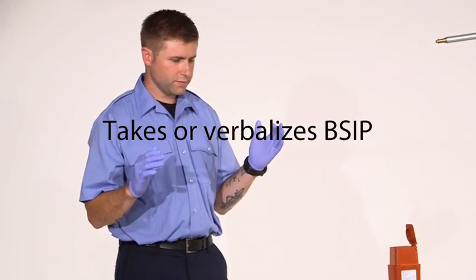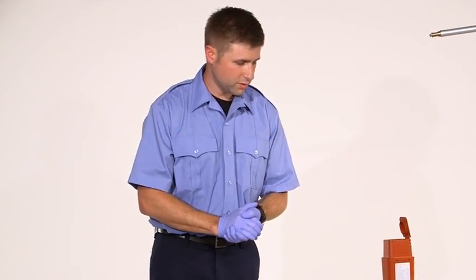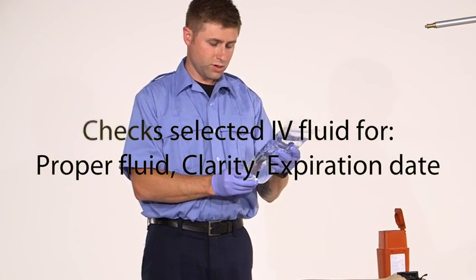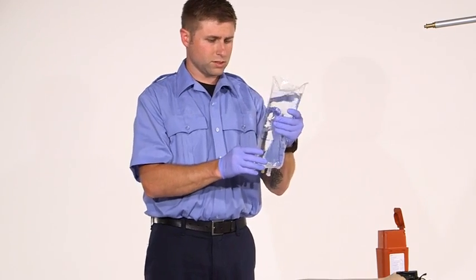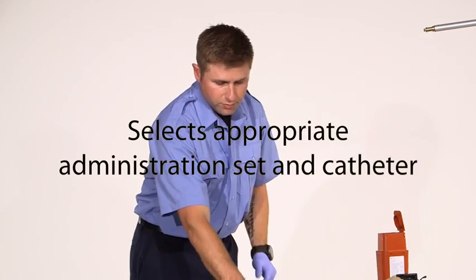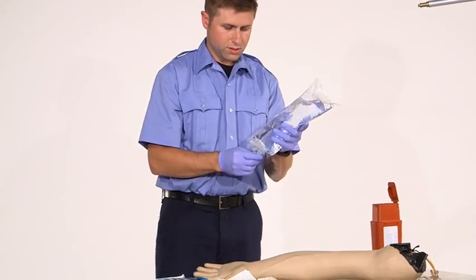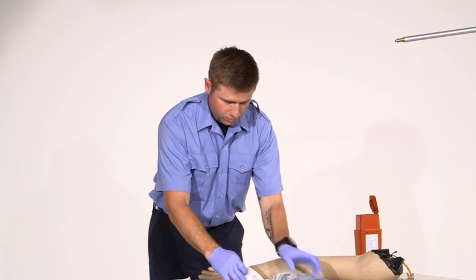BSI, scene safe. All right, I'm going to place a catheter into this arm and check my fluid. First, I'm going to make sure I have the right fluid, that my fluid's not expired, and the clarity of the fluid. Make sure it's nice and clear. I'm also going to make sure I've got my drip set and the correct catheter and all the supplies that I need. At this time, I'm going to take my bag, pull that, and spike the bag.